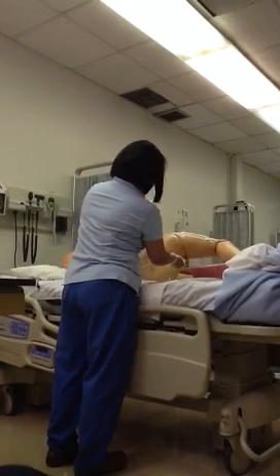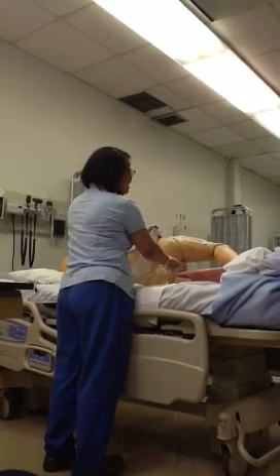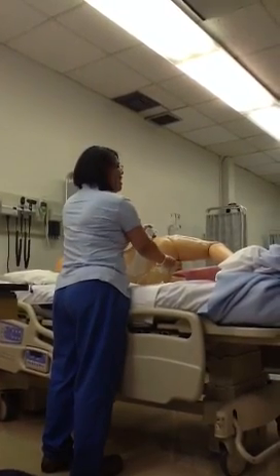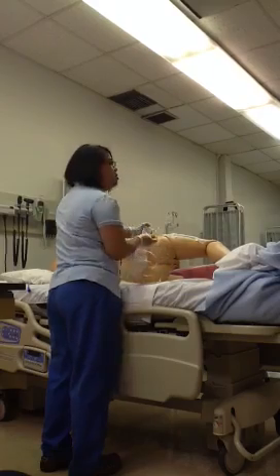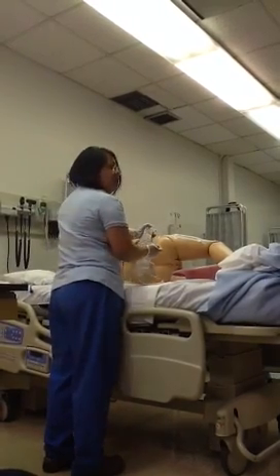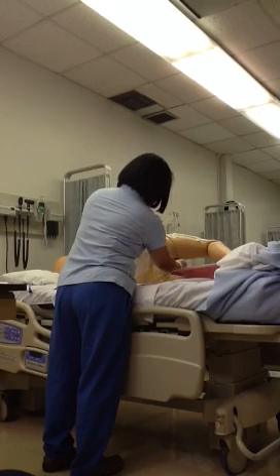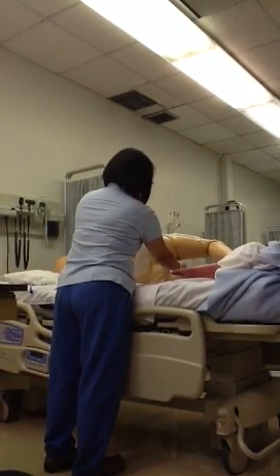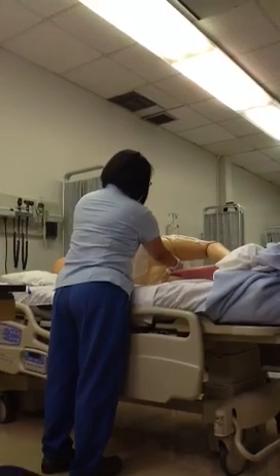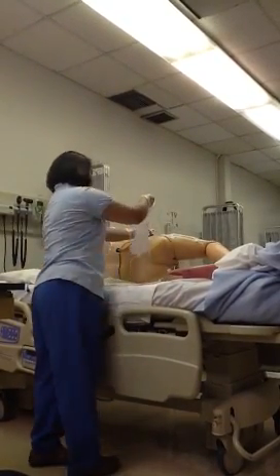And then I'm going to go into his rectum, and I'm just going to tell him, I want you to relax. Take some slow, deep breaths, and you're going to go in. This is something that you just don't shove. Okay, so gently insert it into the rectum. Okay, tell him to relax. Okay, the whole thing doesn't go in, y'all. I'd say about 3 inches goes in. All right? Once he has that in, tell him to relax.